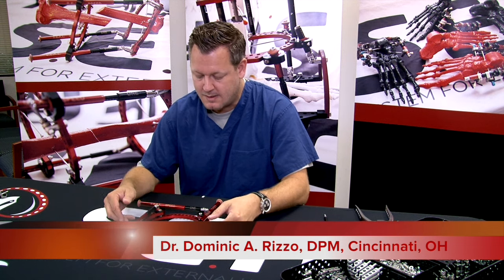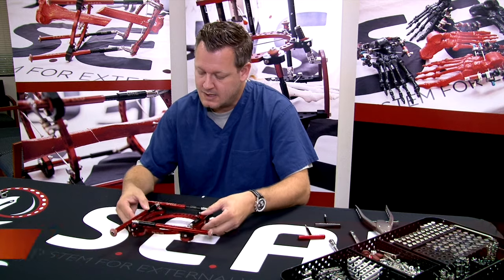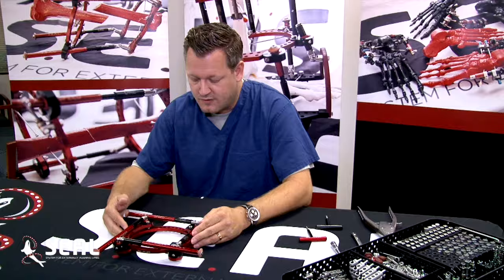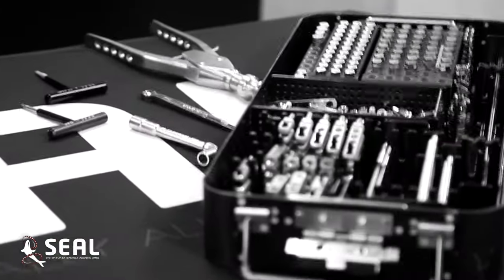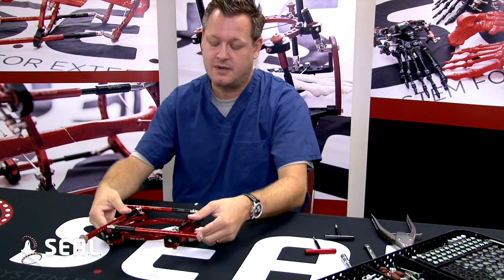Hi, my name is Dr. Dominic Angelo Rizzo from Cincinnati, Ohio, and I'm here to discuss and introduce to you the SEAL Speed Frame. As you can see, it's an extremely versatile frame. The frame will come to you pre-assembled and packaged in a nice, neat shell, with its own tray and some very low-profile, form-fitted structure. That's one element of versatility of the Speed Frame.